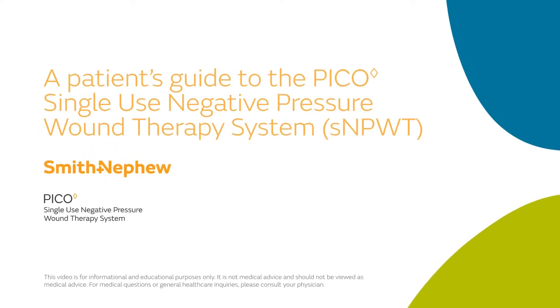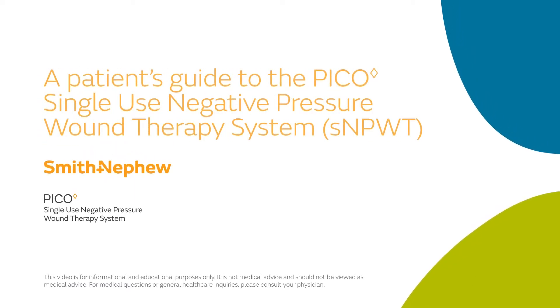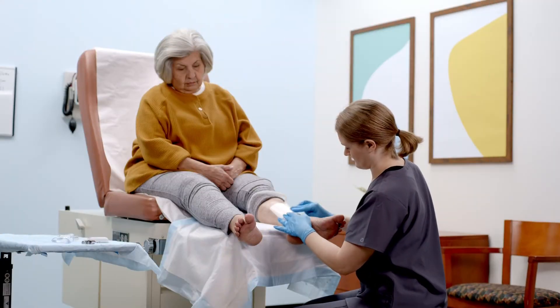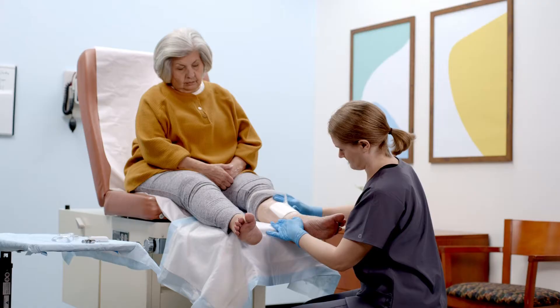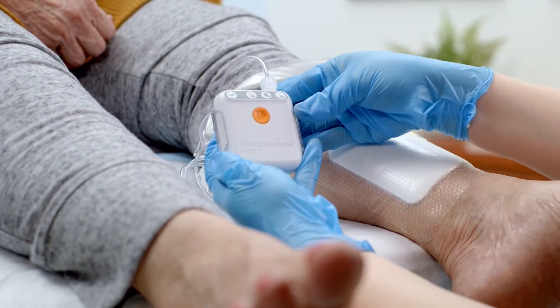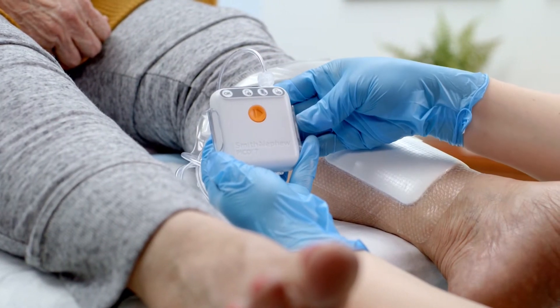A Patient's Guide to the PICO Single-Use Negative Pressure Wound Therapy System. They say that time heals all wounds, but sometimes it takes a bit more. That's why your health care provider has prescribed the PICO Single-Use Negative Pressure Wound Therapy System.